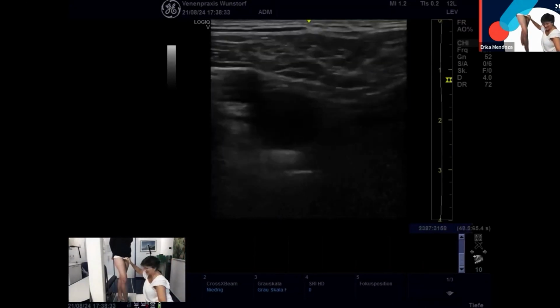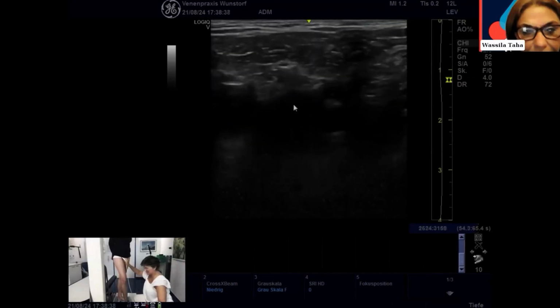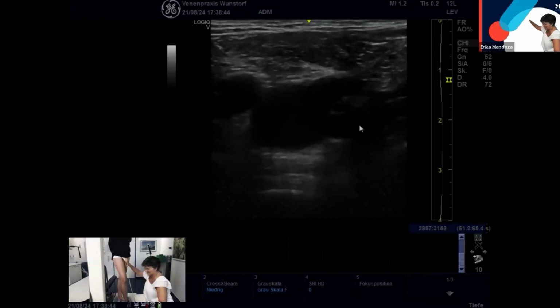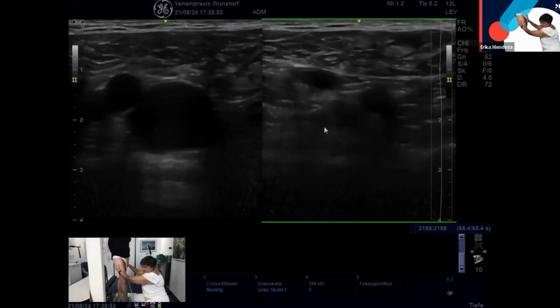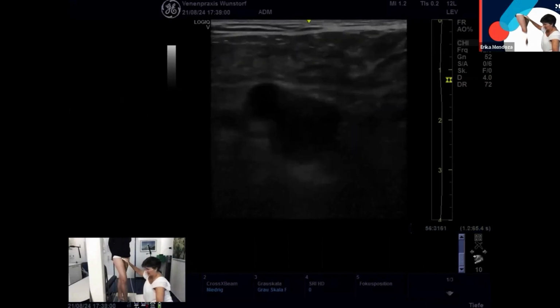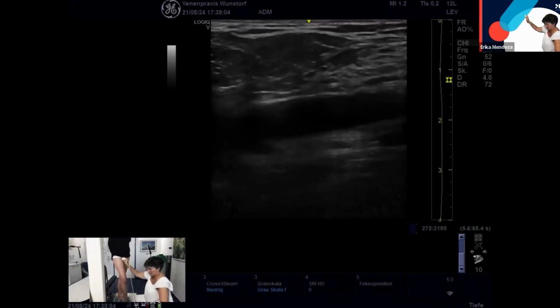So we have the artery and the deep vein in the groin. The junction, we can see it. In the second element, the very interesting thing, we have a pudendal vein draining directly to the deep vein. I always say it is like a fingerprint that can identify every person. So we have the compression, and now we look at the junction.